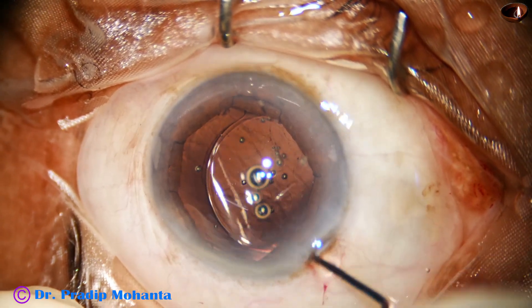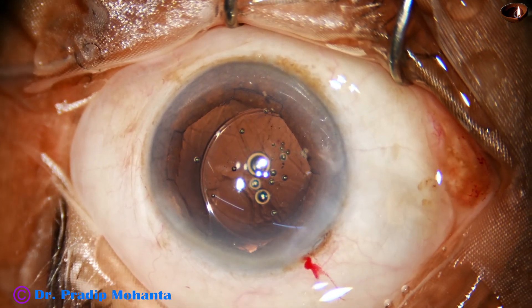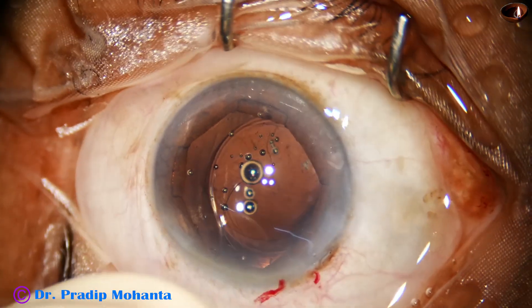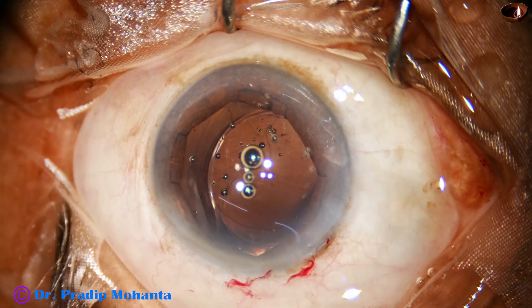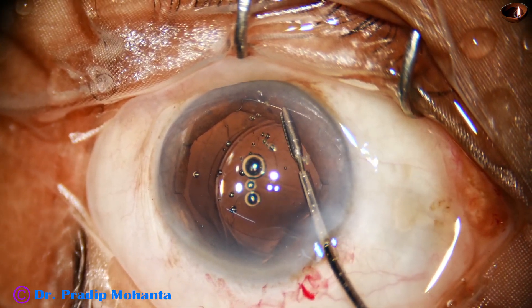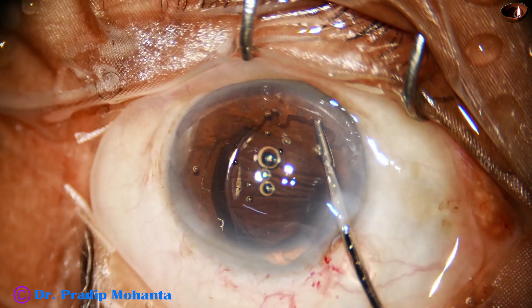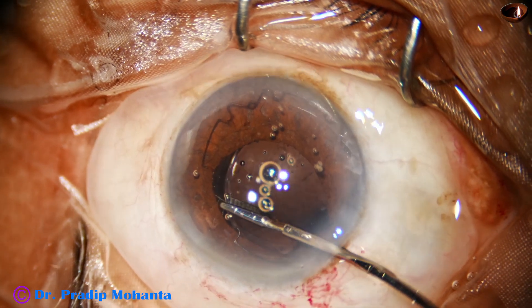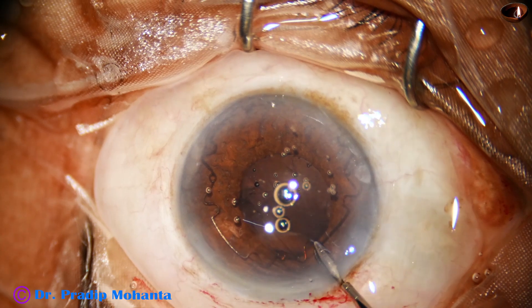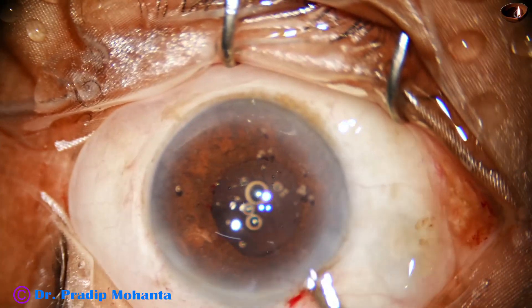Now the lens goes into the capsular bag and is dialed into position. I am going to inject some viscoelastic and then remove the B-Octa ring. I hold the flange at 7 o'clock and untuck the adjacent two flanges, then hold the flange at 2 o'clock and untuck the other two flanges. The whole device comes in front of the iris and is then gently pulled out.